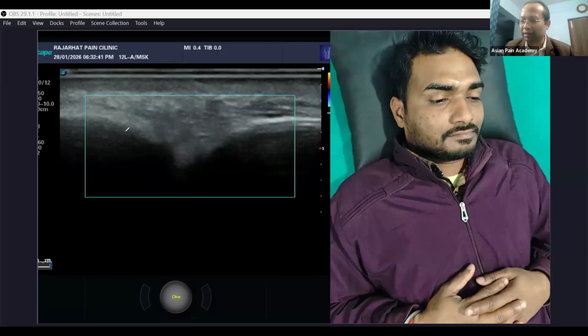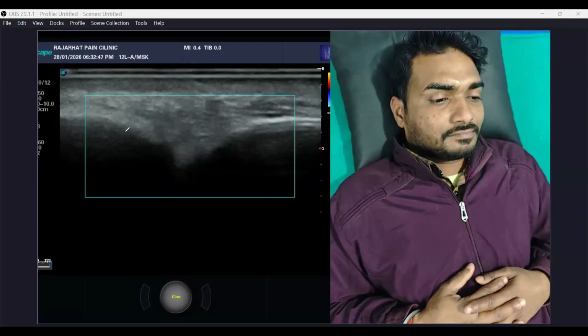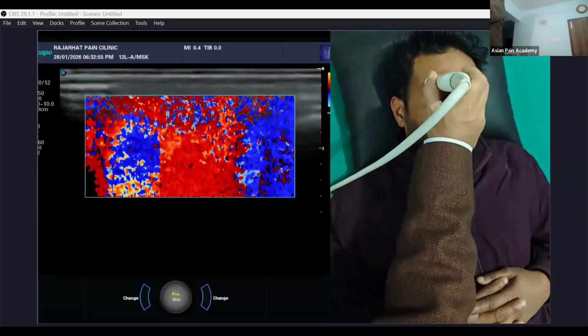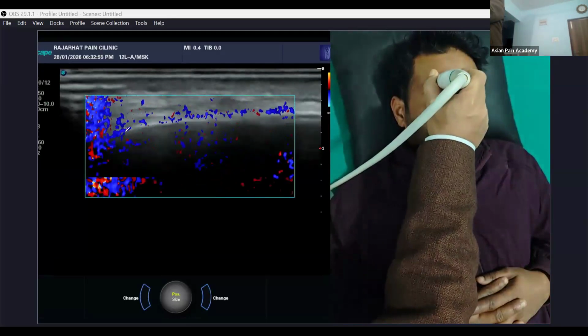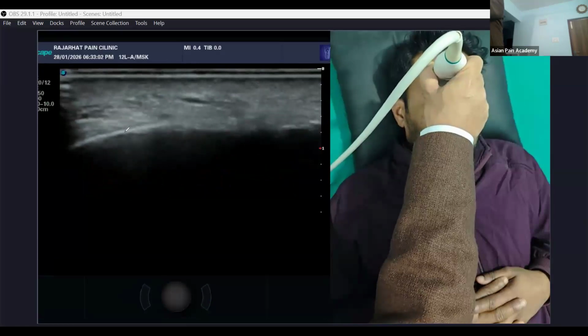No, your question was something else. So if you fix the picture, then let us understand. So the picture is, using the color actually. Oh, I should remove the color.